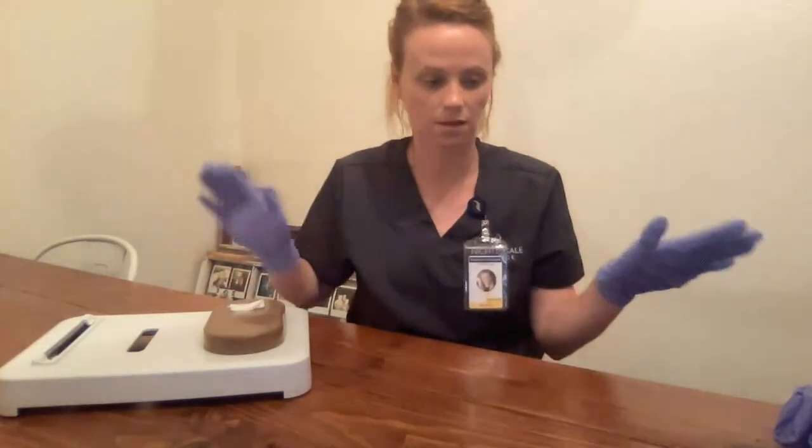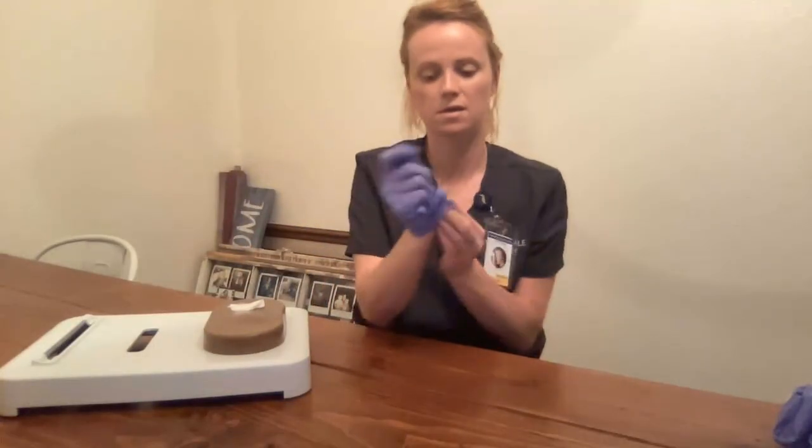I'm going to check I don't have any supplies — there are none. I'm going to remove my gloves. Hand hygiene. And leave my patient's room. Thank you.